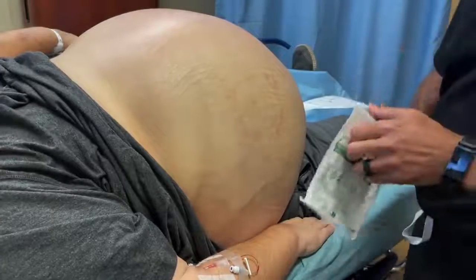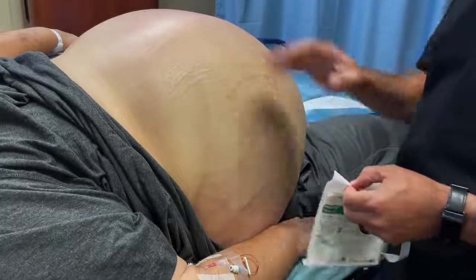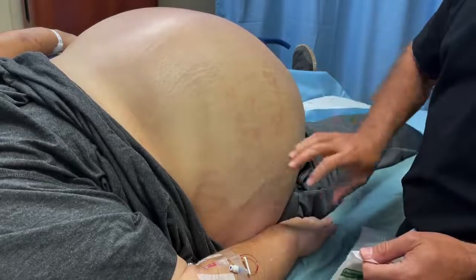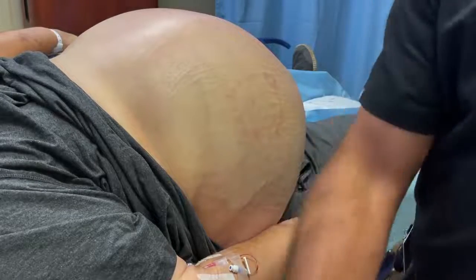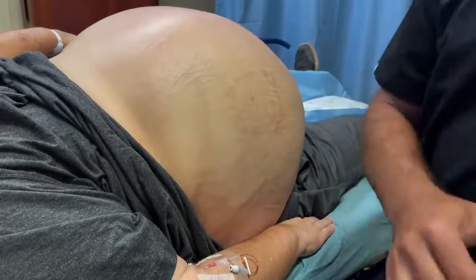So for the purpose of the video, the patient has a history of non-alcoholic liver cirrhosis that leads to fluid retention. He's had previous paracentesis, which is a procedure we're going to do now. We put a needle into this fluid called ascites and we get it drained. He's had high volume paracentesis, more than 14, 15 liters. 15's been the most.